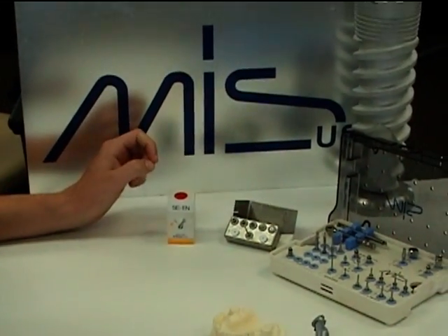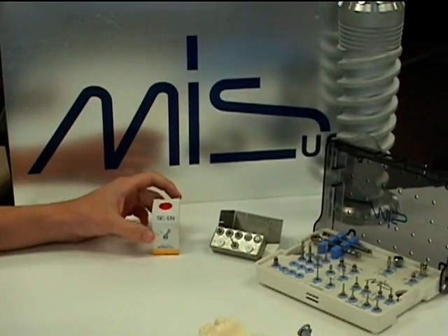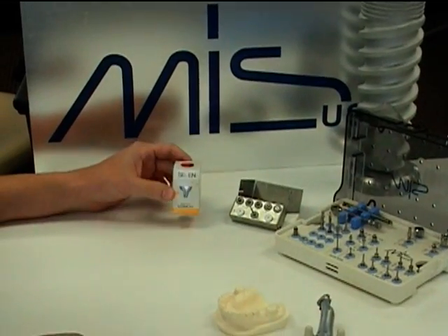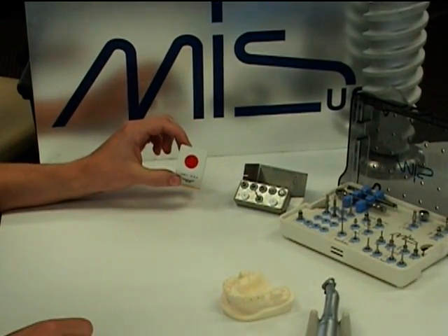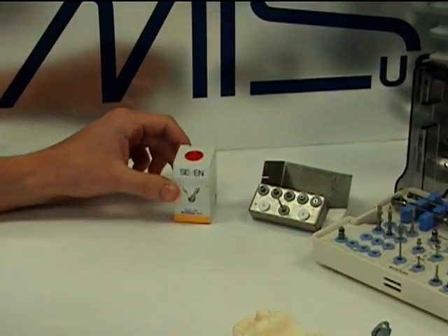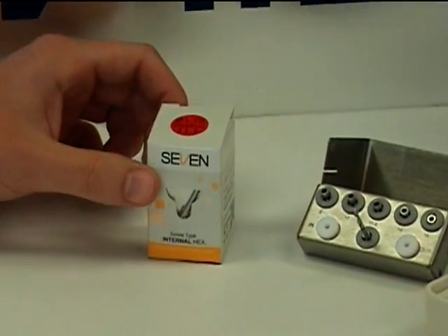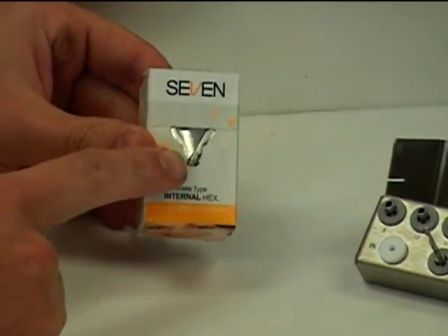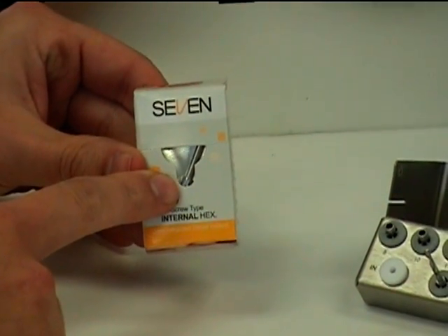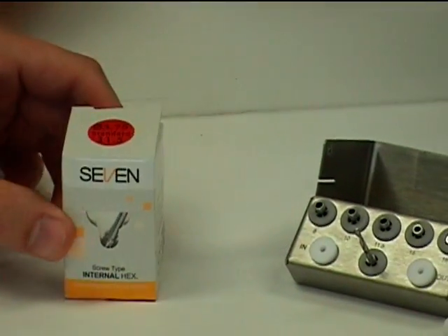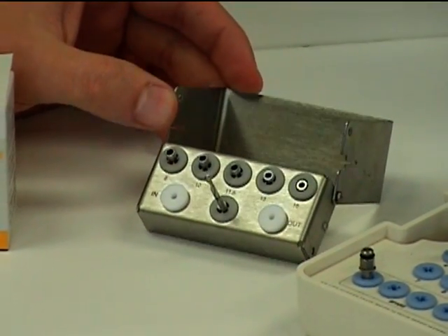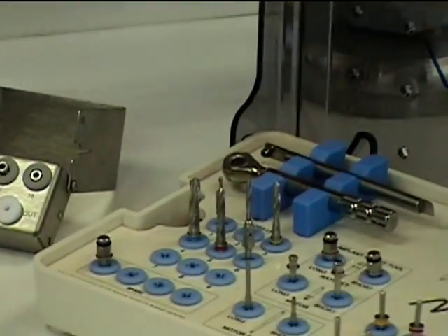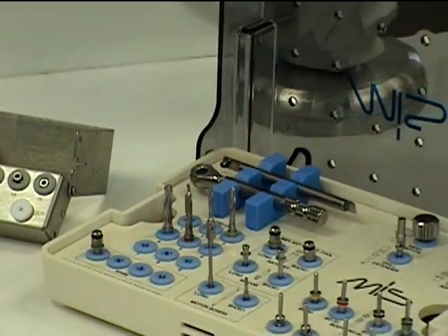So what we're going to be doing today is preparing the osteotomy for the MIS-7 style of implant. The size is 11.5 in length by 3.75 millimeter diameter. It is a standard internal hex. What's unique about the implant is that it comes with a single-use final drill, which we'll be using. We'll also use the MIS drill stopper kit, the MIS surgical kit, and a W&H motor and handpiece.